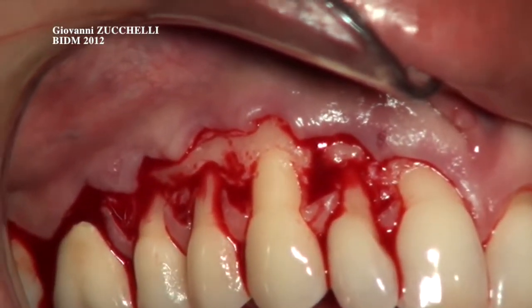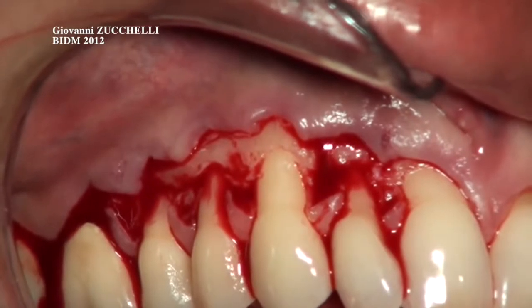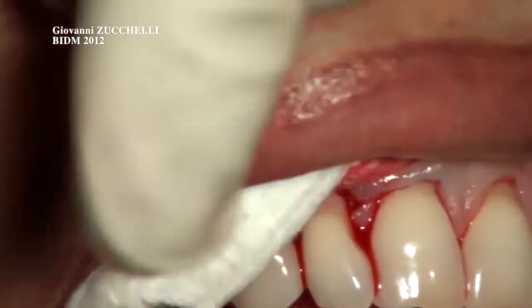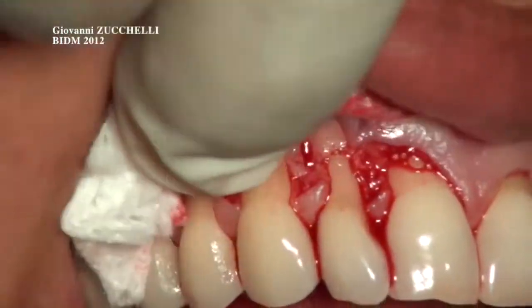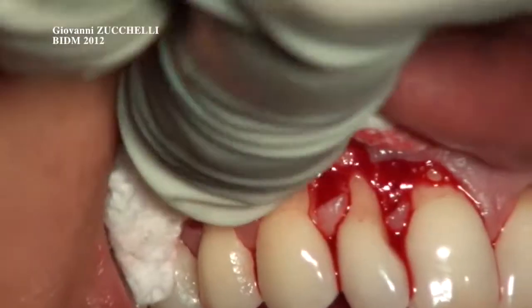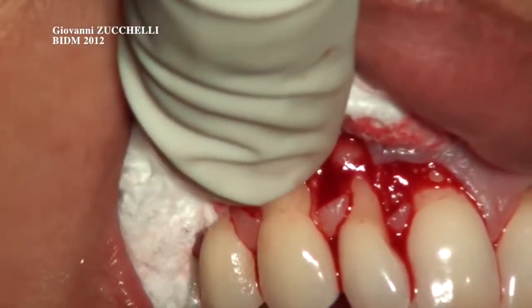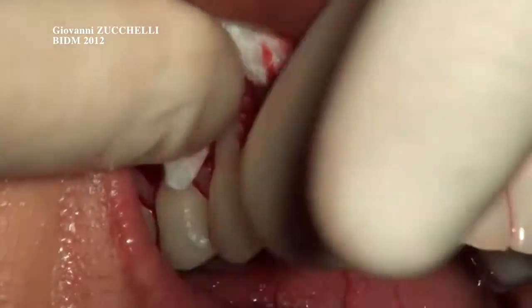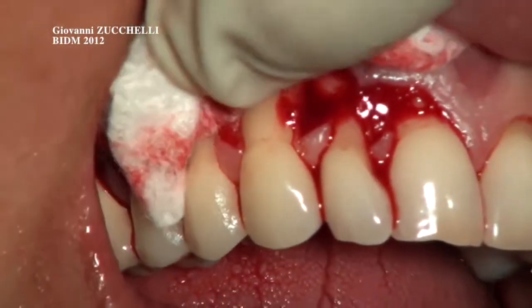This part of the surgery is called de-epithelialization of the papilla. Again, we take a gauze, we go on the back of our patient, we isolate with the gauze and with your finger, the lip. Please come here.